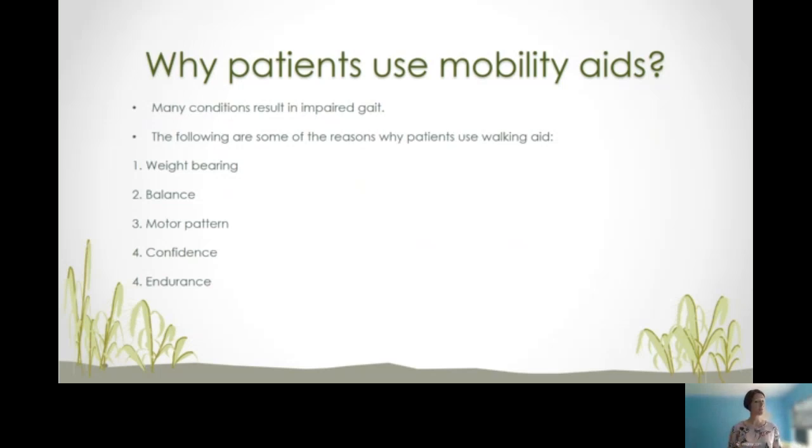A walking frame will give them some confidence and will allow you to get out of the bed and improve your circulation through mobility, and that will prevent complications of bed rest. So all of that by giving them a bit of confidence when you add a mobility aid.